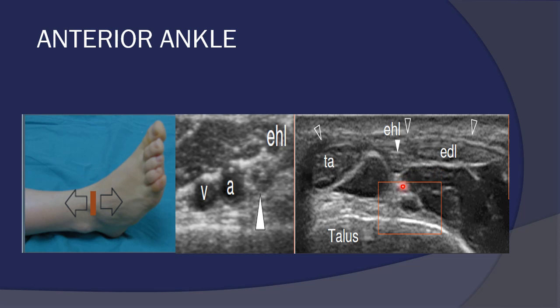In case I've got mixed up with the tendons, I can just trace this tendon, for example, till the foot. You'll find that it will split into four parts, inserting into the second, third, fourth, and fifth distal phalanges digits. Thus, this means that this is the extensor digitorum tendon.